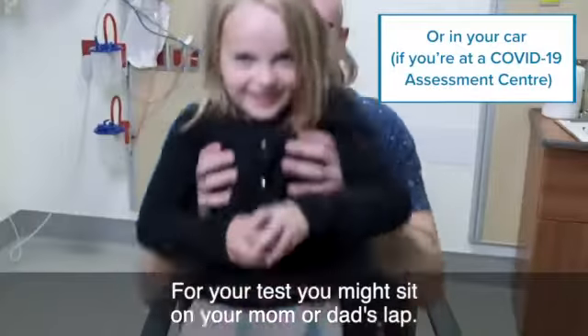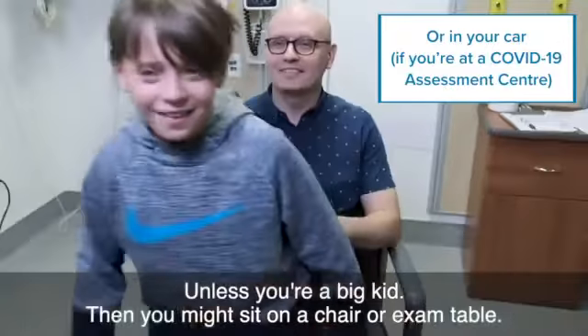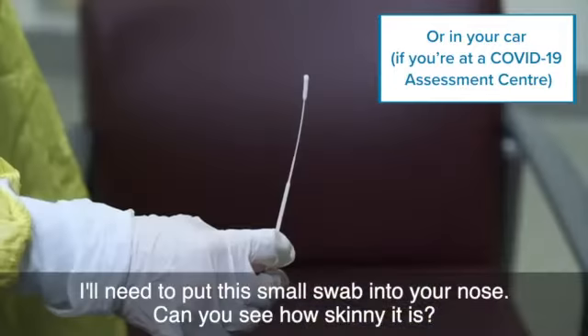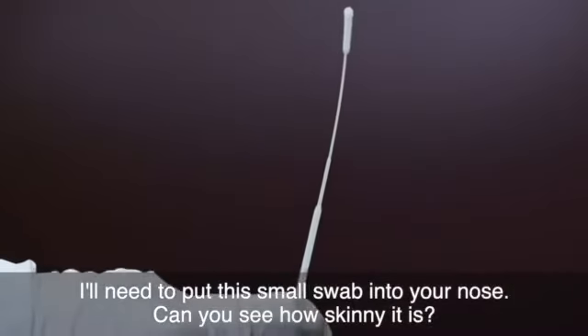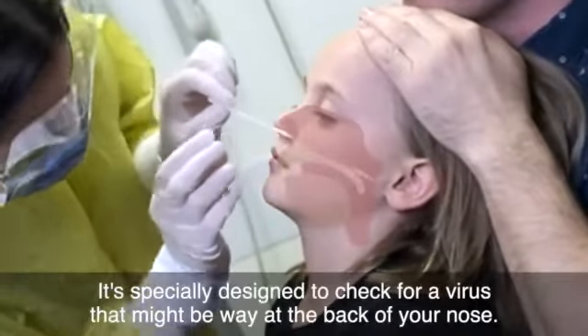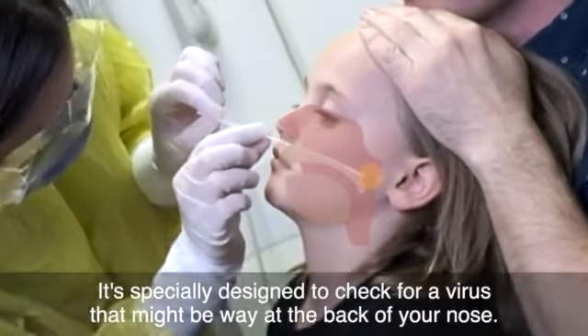For your test, you might sit on your mom or dad's lap, unless you're a big kid. Then you might sit on a chair or exam table. I'll need to put this small swab into your nose. Can you see how skinny it is? It's specially designed to check for a virus that might be way at the back of your nose.